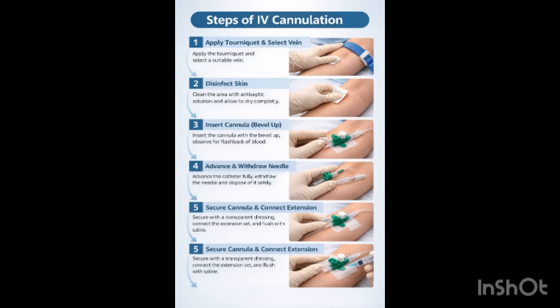So the other important thing to consider, you need to make sure of personal safety, and prior to putting the cannula, you need to think whether this patient needs a cannula or not, and then how many goes should I have before calling for assistance. You can try 2-3 attempts if you're a doctor, and if you're just a student, you can go for 1-2 attempts without making those veins unusable.